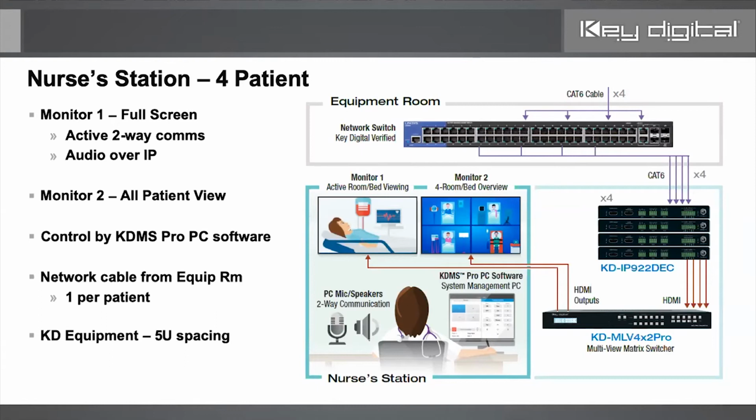Why? Because maybe a non-verified network switch could work in the beginning, then 6 months down the line, the whole thing fails. So we highly recommend you look at our verified network switch list when you're speccing in these systems, so that we can ensure that these systems work for years and years and years. Those switches have been on in our lab for years. Literally, we do not turn them off. So what's on our website, just use those.